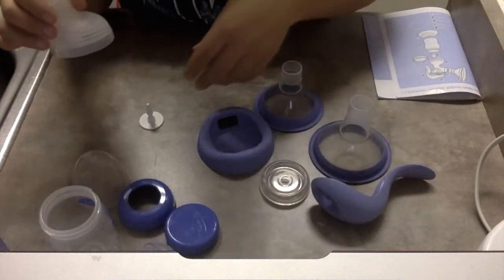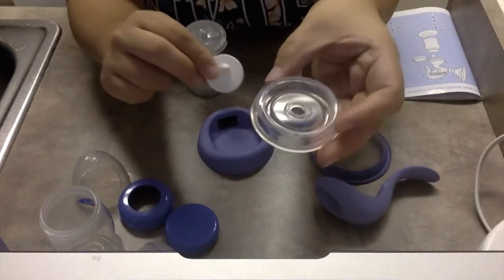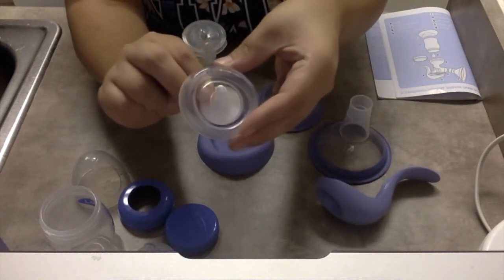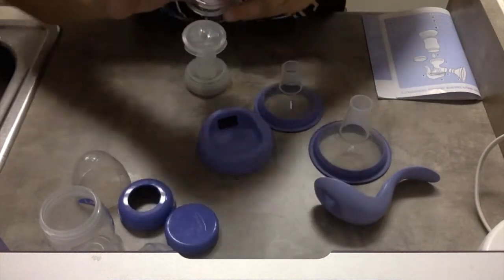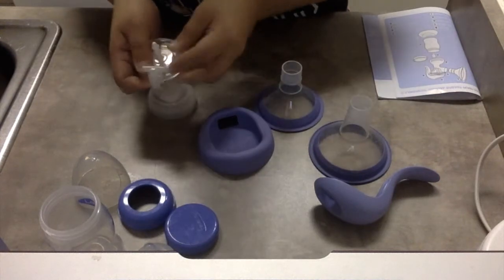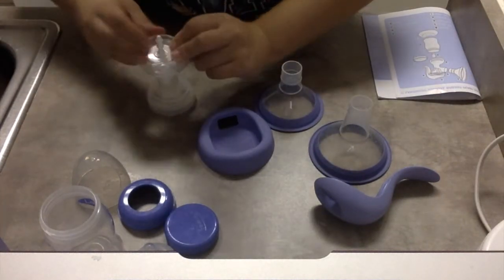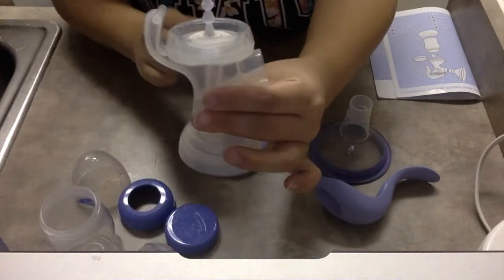And then you're going to take your stem and your silicone diaphragm. There's a hole in the middle. You're going to stick this up just like this, and you're going to stick it on top of the flange body. So there you go. You want to make sure it's a nice tight fit on there.